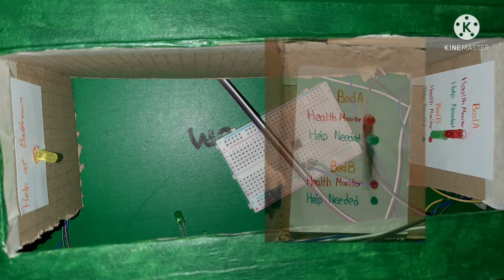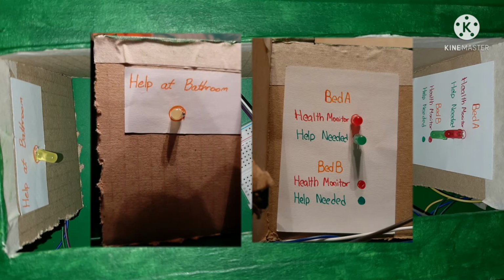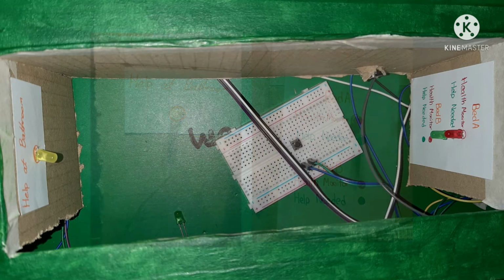The red LED indicates patient's health and will blink together with a buzzer if patient's health is at risk. The green LED is triggered if a patient calls for help from his or her bed. Meanwhile, the yellow LED is triggered if the patient calls for help from the lavatory.